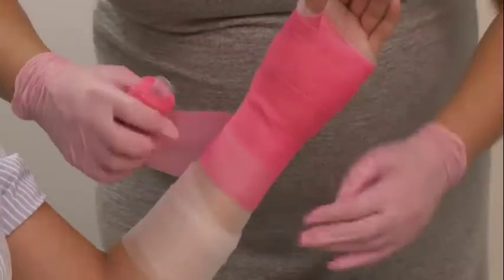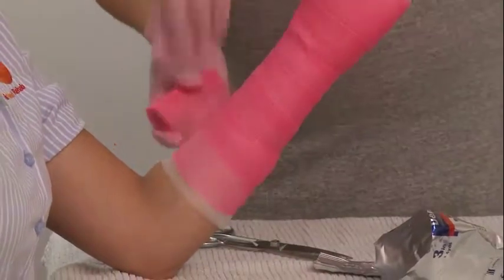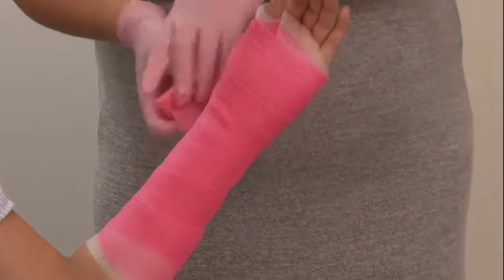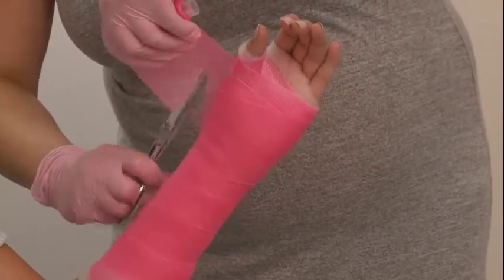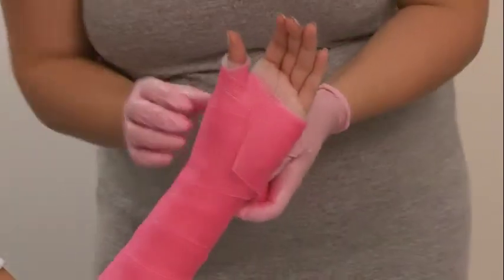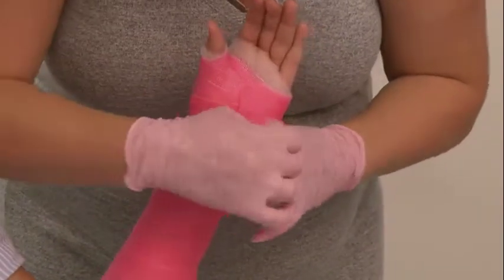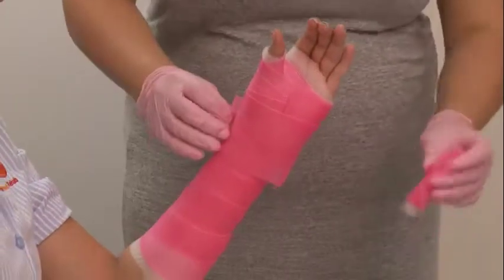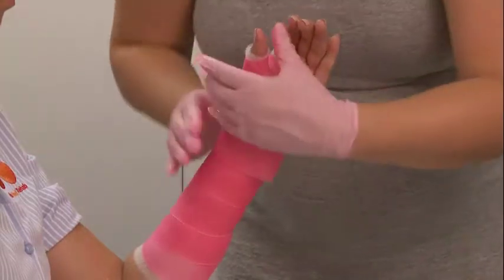You're going to roll down the forearm. You only need one to two layers in the forearm — you only want to end with a minimal amount of casting material. Anything more than two layers becomes quite hard and uncomfortable on the patient. Rolling back up again, we'll do one more layer through the web space. Make your incision in line with the first ray, leaving about a centimeter, and make sure your edges are really nice and smooth — roll them under so there are no sharp edges. Capture that edge with the rest of the material. You don't need to use a whole roll if it's not necessary. From here I'm just going back and adding a little bit of contouring with my hands, then using the water to start setting the material.